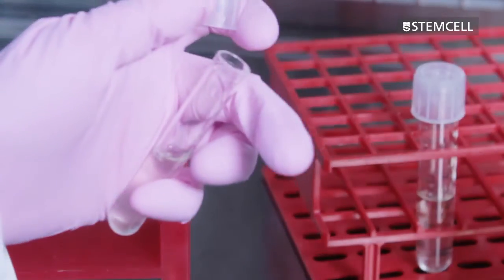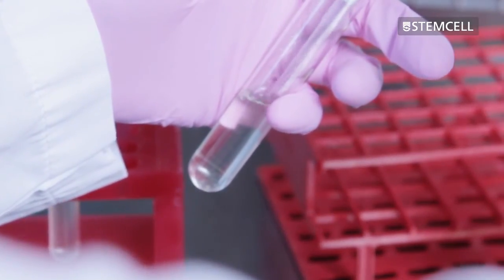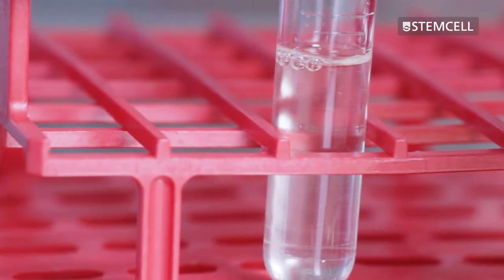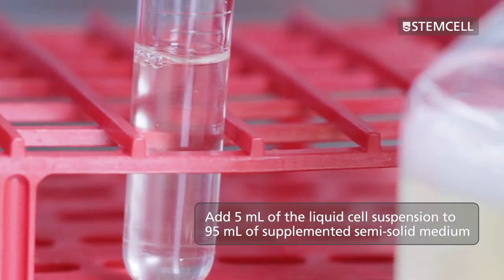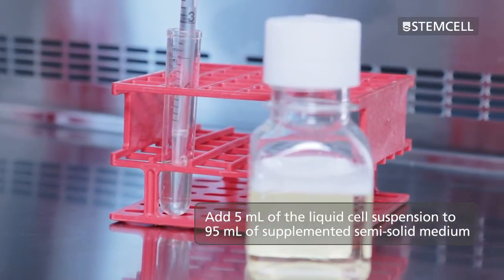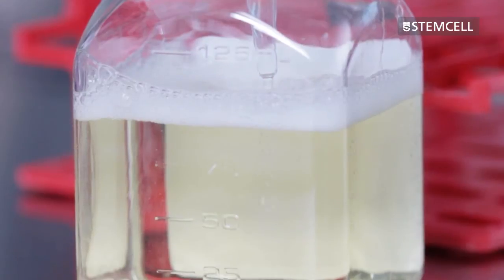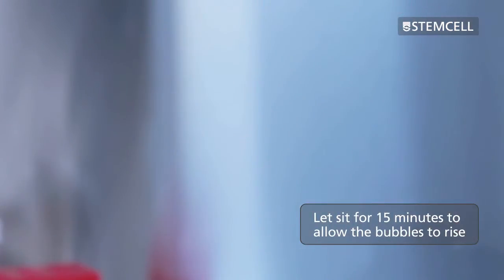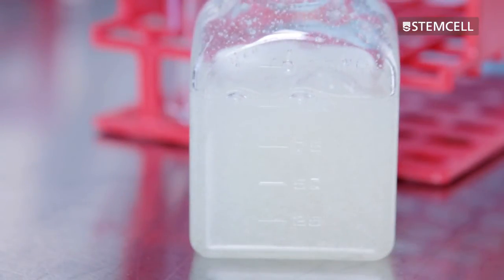Add the calculated volume of cells to an appropriate volume of 1x liquid cell culture medium. You should now have a total volume of 5 milliliters of cell suspension to be added to the bottle. Add the 5 milliliters of liquid cell suspension to the 95 milliliters of supplemented semi-solid medium in the bottle. Mix thoroughly and let sit for at least 15 minutes to allow the bubbles to rise to the top. The cells are now ready for plating.